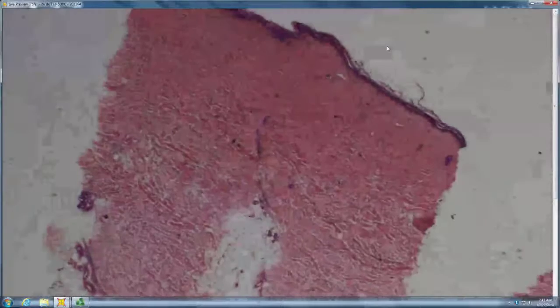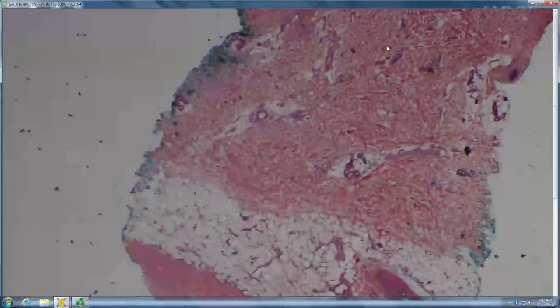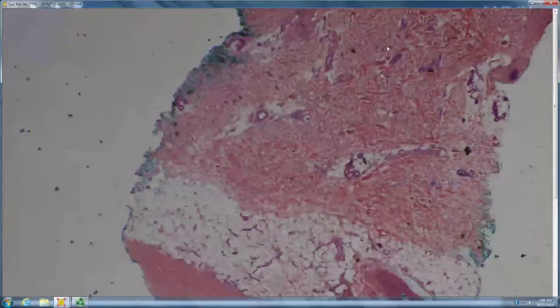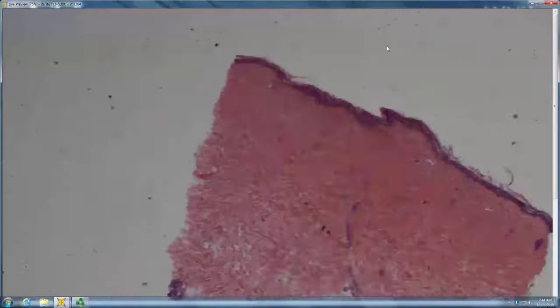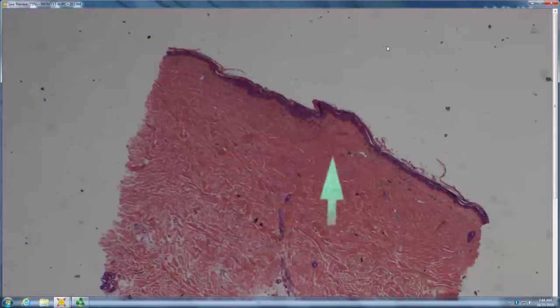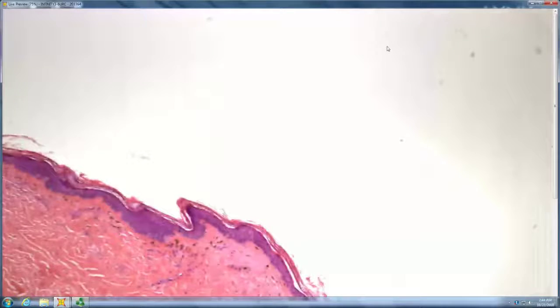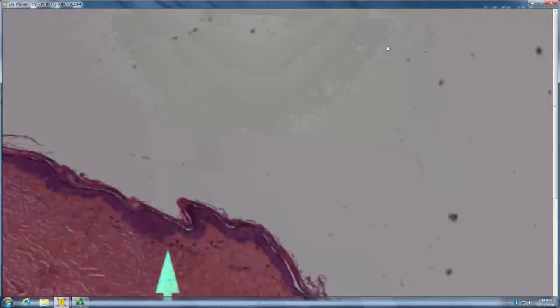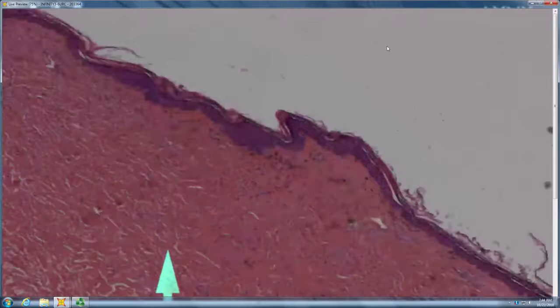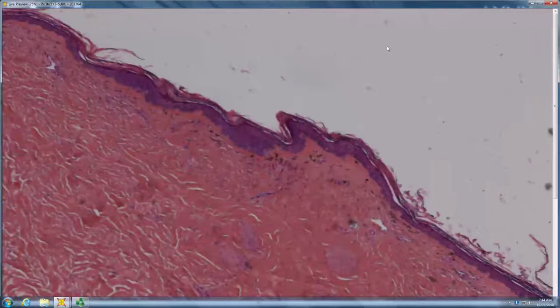Punch biopsy. Is it morphea again? So, it could certainly be morphea profunda, given the deep sclerosis. And there's also superficial sclerosis as well, which could be morphea. But I see some pigment incontinence. Lots of pigment incontinence, suggesting that there was interface dermatitis, which you don't usually get in morphea, right? Yeah. So you have features very much like morphea, but some things against morphea. Do you think this was radiation?